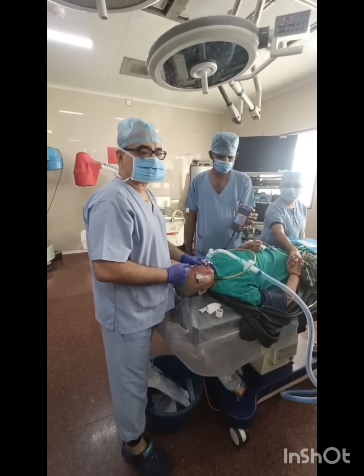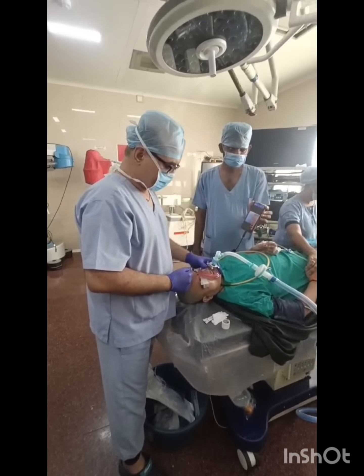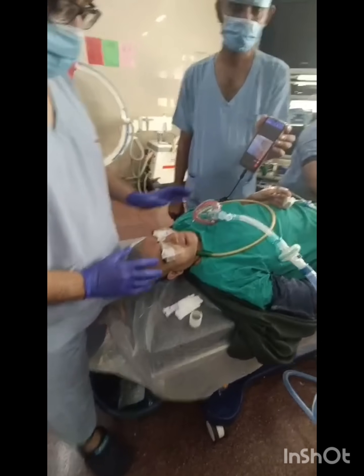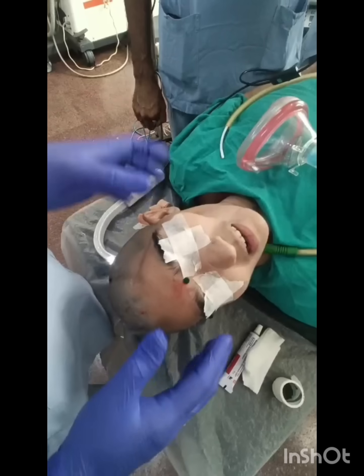She is a known case of operated buccal carcinoma with restricted mouth opening, and she has been posted for cranioplasty.